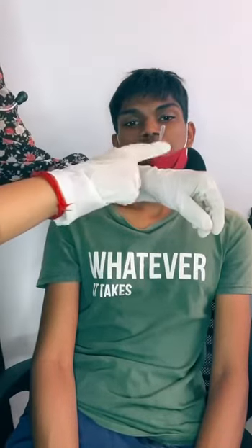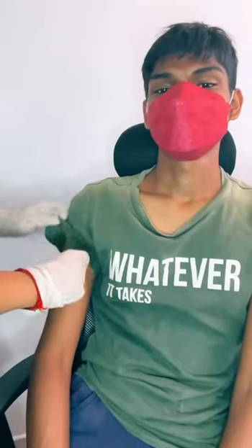Shake the thermometer in order to calibrate it to room temperature before placing it in the mouth. Third, axillary temperature.